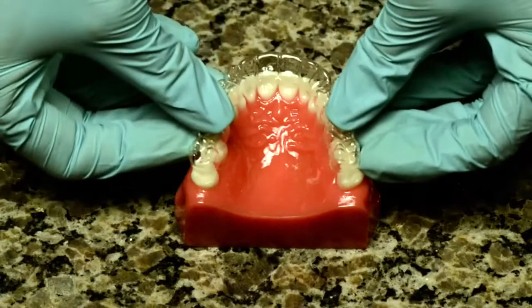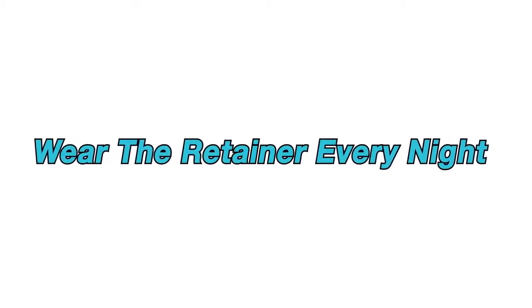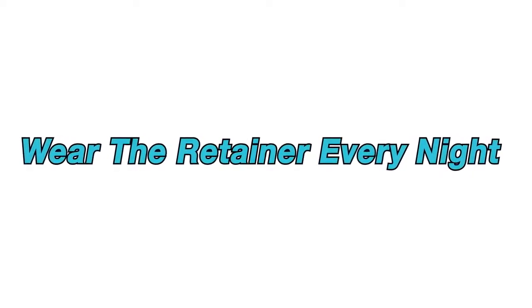The second type of retainer is a removable retainer. We call these clear or Essix retainers. They are clear and fit over your teeth similar to a contact lens. The clear retainer should be worn every night unless otherwise specified by our orthodontist.